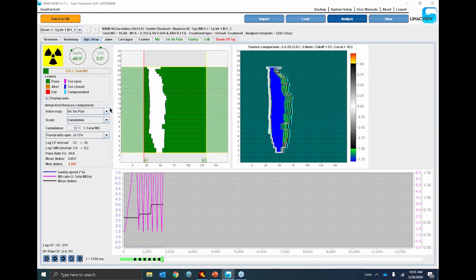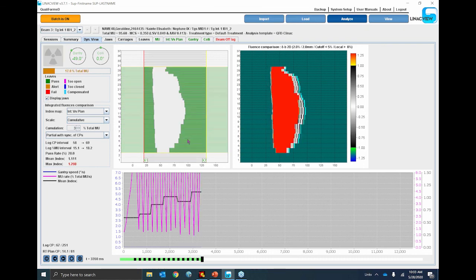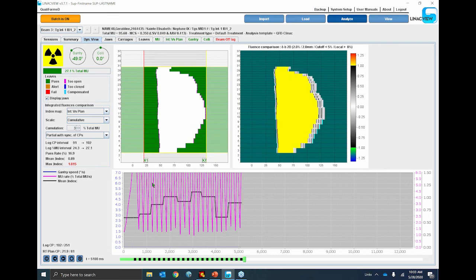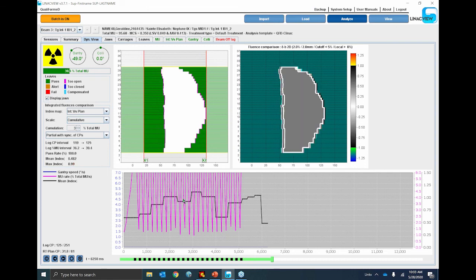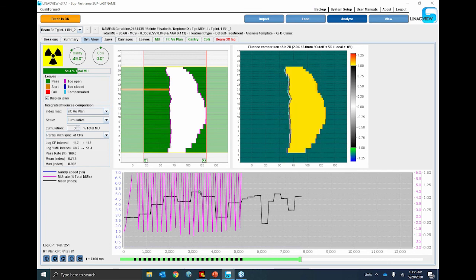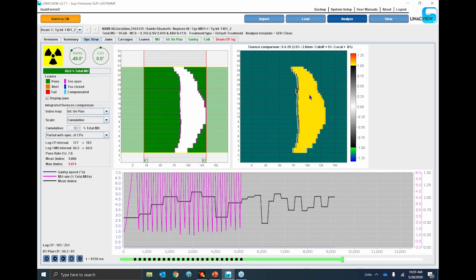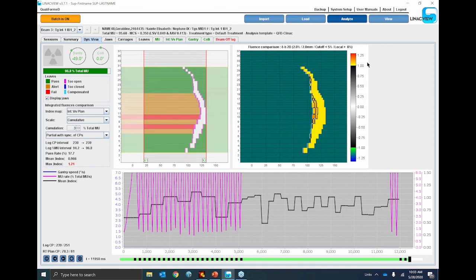And you can see when you're getting all of these leaves that are at alert and tolerance level, that the beam is going on and off. And the mean index is higher than one would expect, and when it's high, that's when the beam off lags are occurring. But you can see sometimes there is coloration in the fluence comparison map. When there's coloration, that means we have fluence that is outside the plus or minus 1. And so those are the areas we're really looking for.